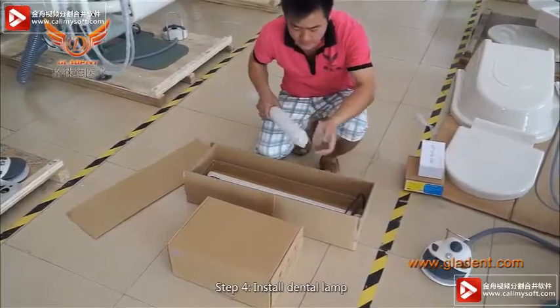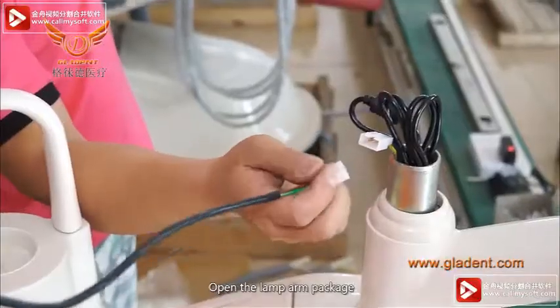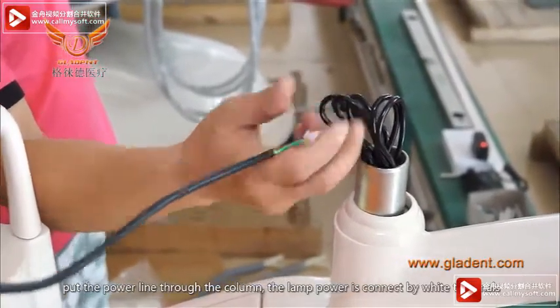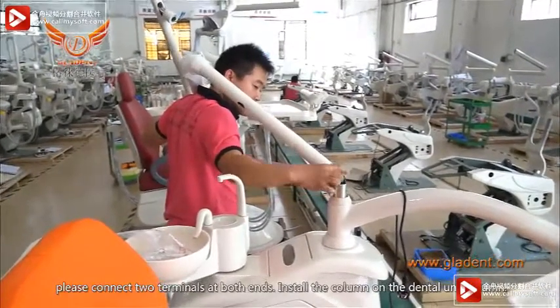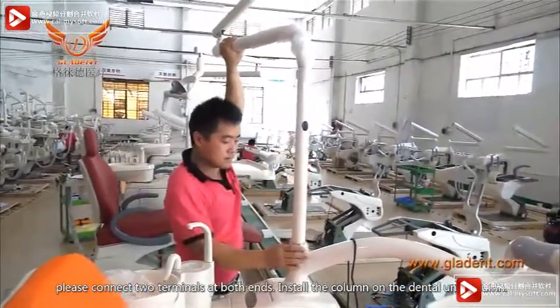Step 4. Install the dental lamp. Open the lamp arm package. Put the power line through the column. The lamp power is connected by wire terminals — please connect the two terminals at both ends. Install the column onto the dental unit column.